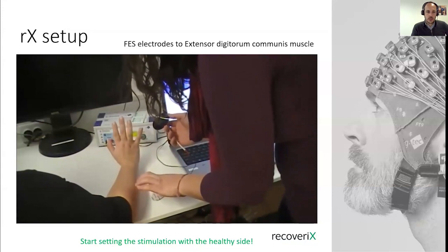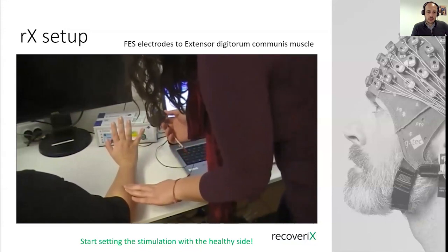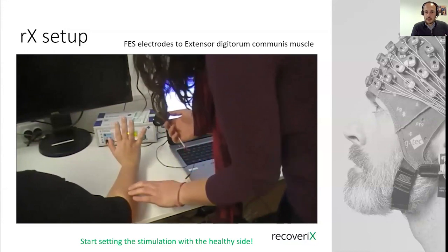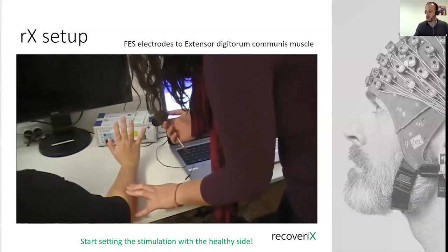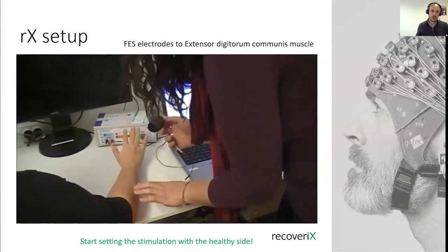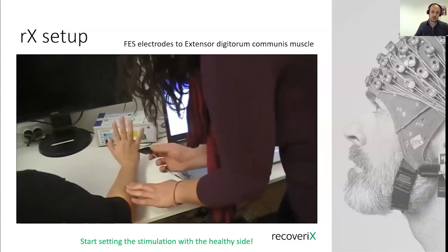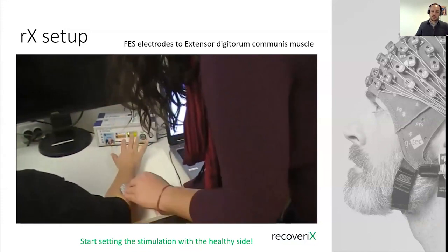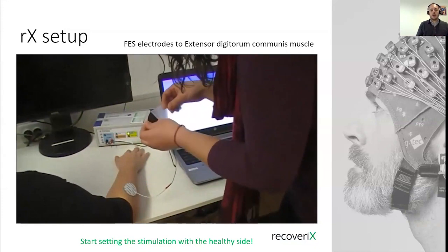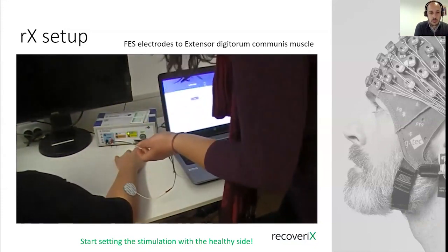So we are using the same FES electrodes during 5 sessions. After 5 sessions, we recommend to trash the FES electrodes away and use a new pair. Because after some sessions, they are not as sticky as at the beginning, and then you can maybe have some problems.